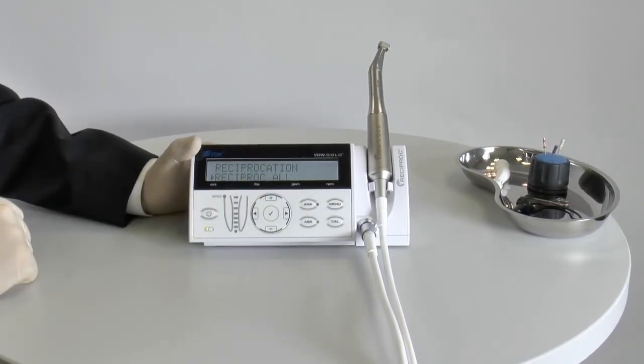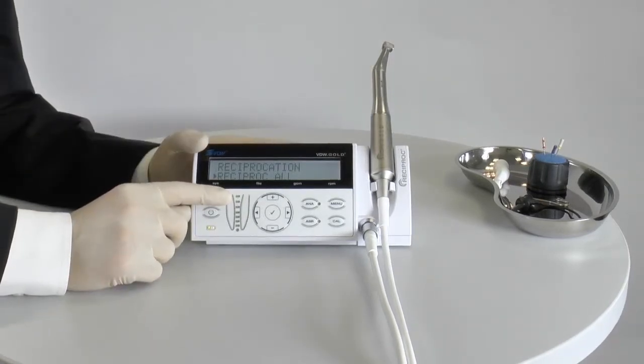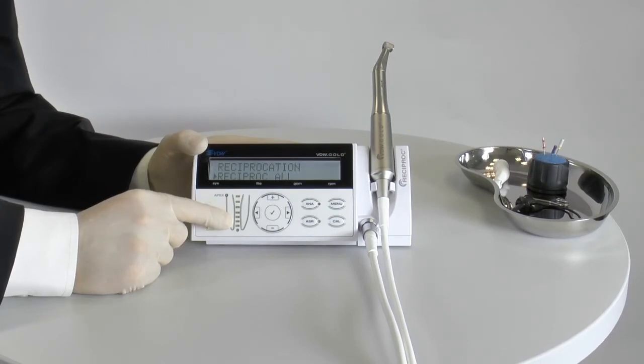The VDW Gold reciproc comes with an integrated apex locator. The LED indicator for electronic length determination is located on the left. More details on this in a separate video.